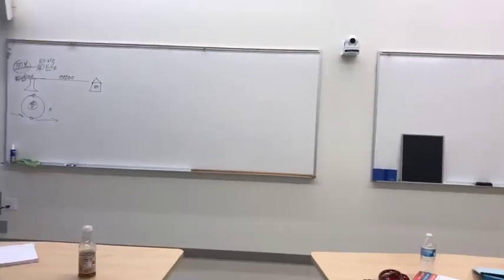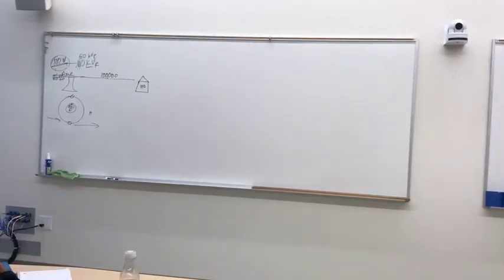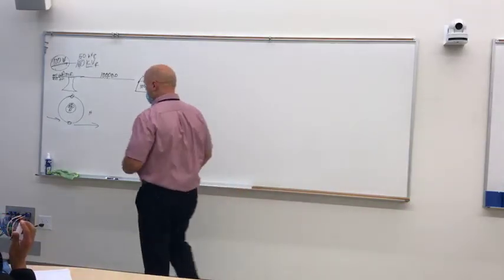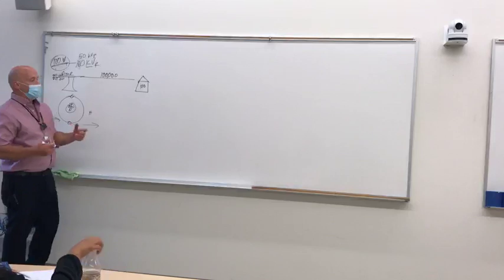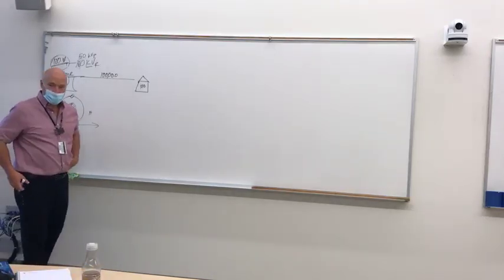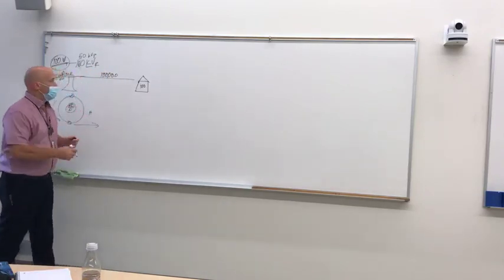You've got something that you've got to give up to get something else, right? So what we're going to do is transform our voltage from high voltage to low voltage. At the same time, because of reciprocity, give and take, our voltage is going to go down, our amperage goes up, okay?